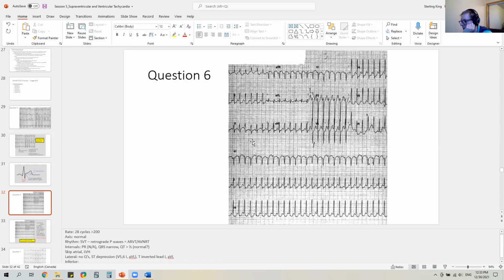Q, no Q. All right, good for Qs, no Qs. ST, depressed. Yeah, it's ST depression there. And you can look at the baseline here, baseline there, that's ST depression. So ST depression. And the T's are up, up, up. So normal T's. All right, now let's go through our precordials.